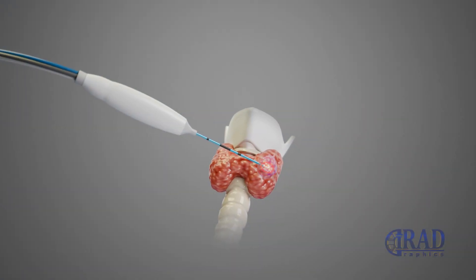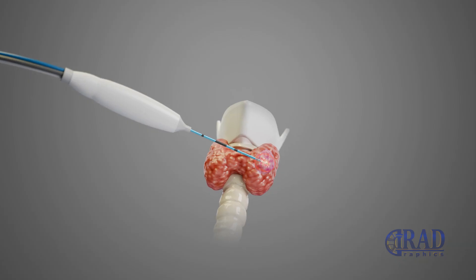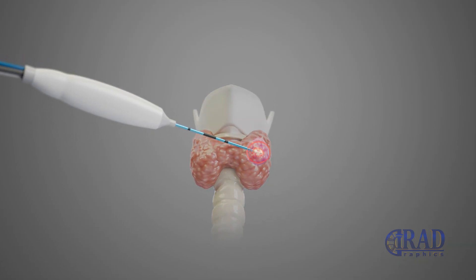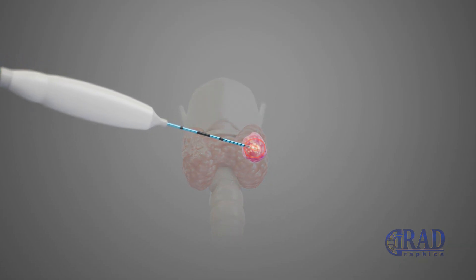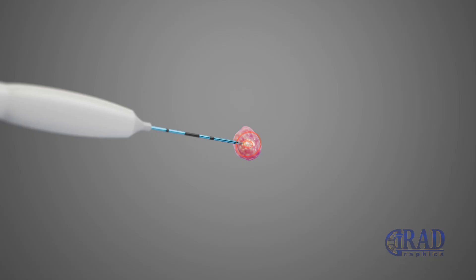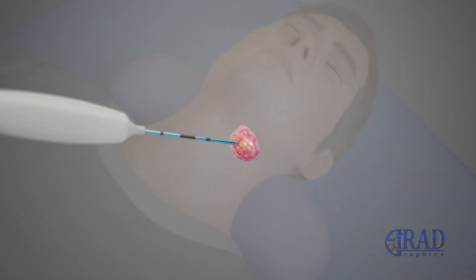This video shows how a thyroid nodule or an overactive parathyroid adenoma is treated using a minimally invasive, image-guided ablation procedure.